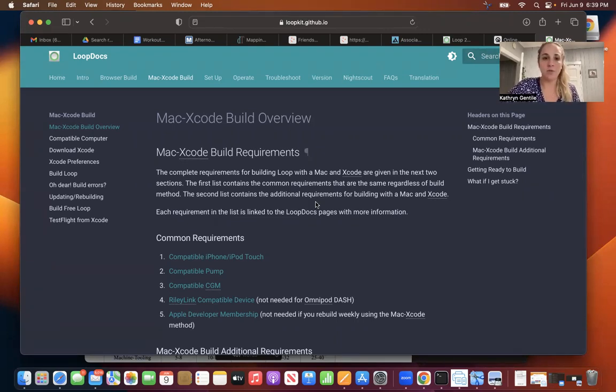Now, anytime you're doing the loop build, you want to make sure that you're running the right compatible iOS version. So your phone is up to date enough, or not too far up to date. You're checking Xcode, making sure you're running the right version of Xcode. And same with your computer, you're making sure that it is up to date or up to date enough, which you're going to find here in the docs. So, double check that every time before you build.